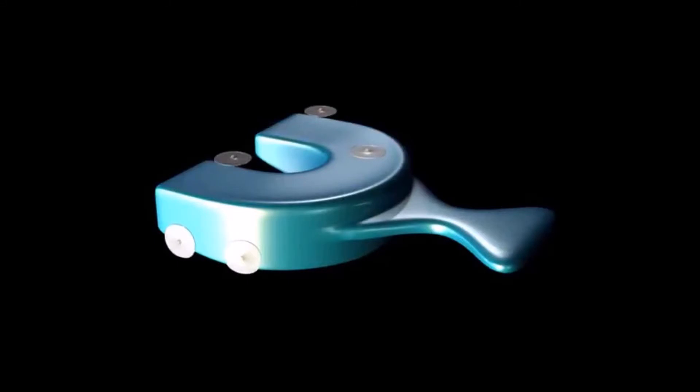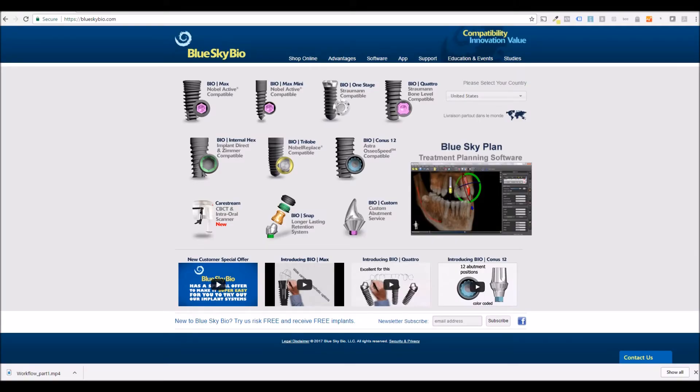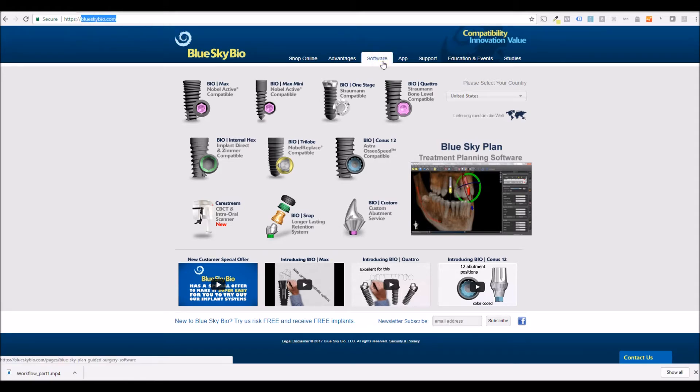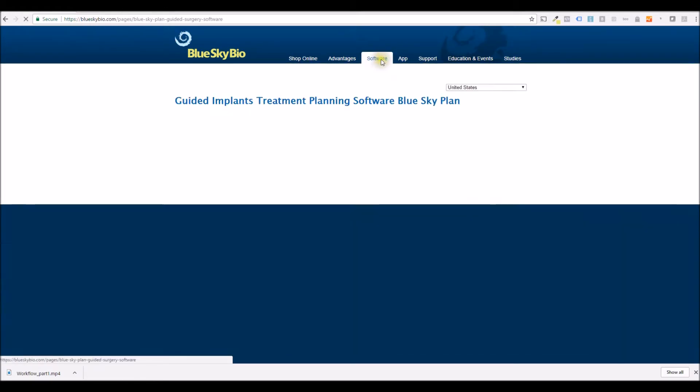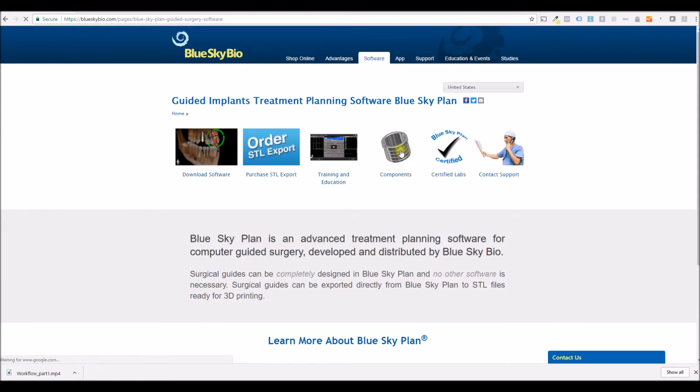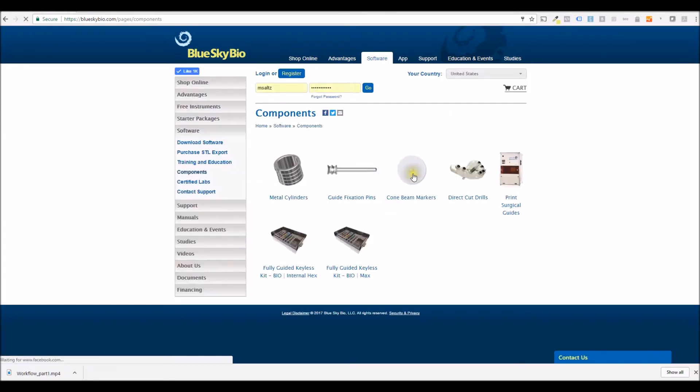In preparation of the case, radiopaque scan markers available via the Blue Sky Bio website should be attached to the outside of an impression tray. The radiopaque markers can be purchased directly from blueskybio.com by clicking on Software, Components, and then choosing Cone Beam Markers.